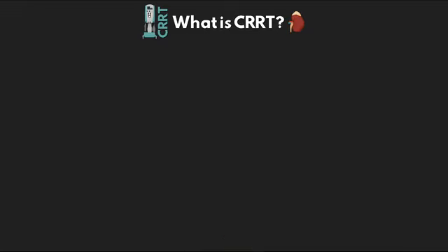Alright, and so let's go ahead and get started here, and let's start off talking about what exactly is CRRT. So CRRT stands for Continuous Renal Replacement Therapy. And so CRRT is a therapy that really is in the same class as our intermittent hemodialysis, IHD, or our peritoneal dialysis, PD.